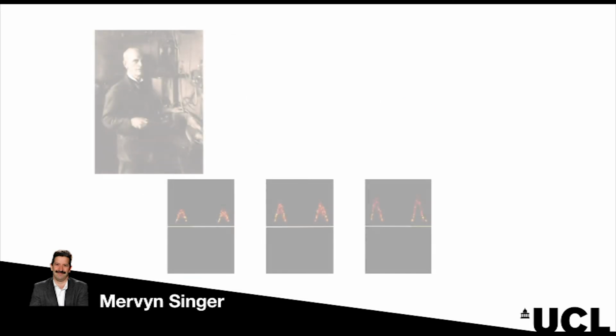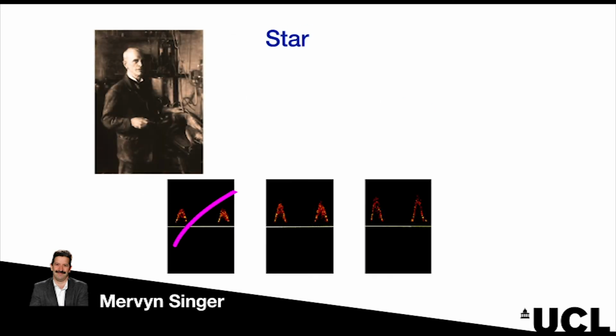As I mentioned before, you can construct a relatively non-invasive Starling curve. So as you give fluid, if the patient does respond to that fluid, the stroke volume will go up. And so you get to a point where the stroke volume no longer increases, and then you're at the top of the Starling curve. And that tells you that the patient is filled. Clearly, there are some examples where the patient may be bleeding out at the same rate that you're putting in the blood, but usually that's known clinically.